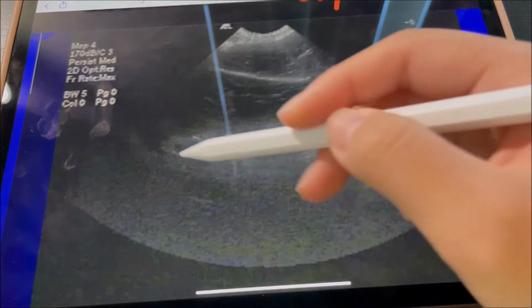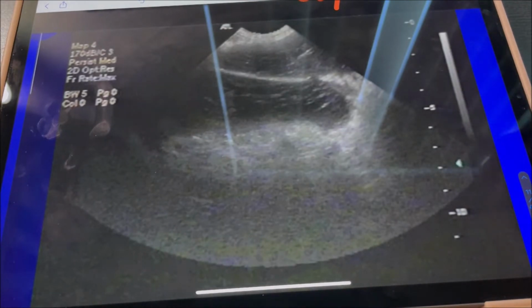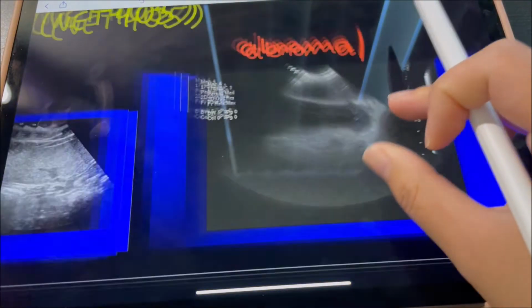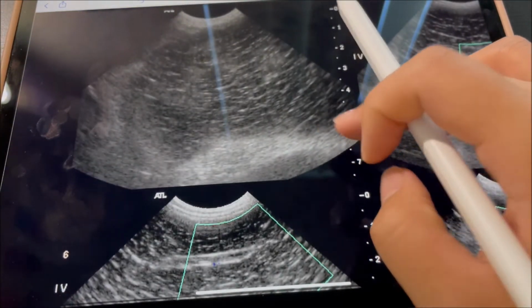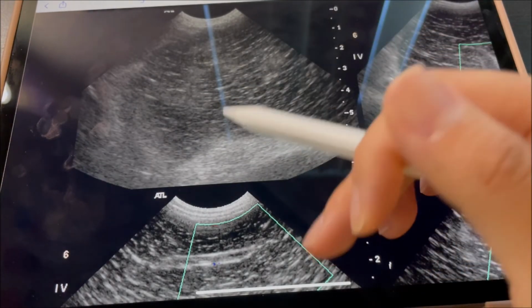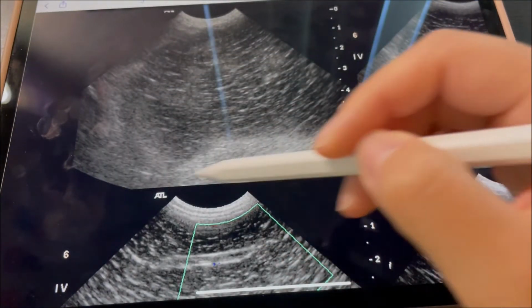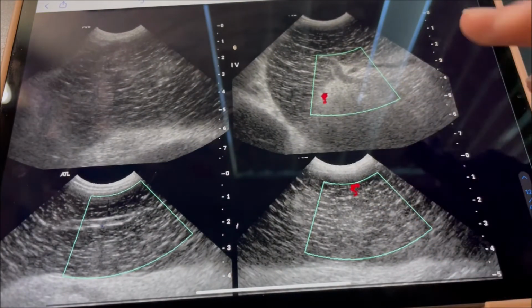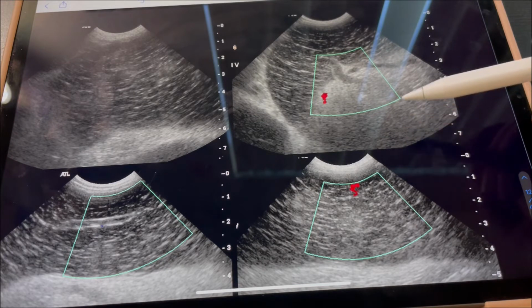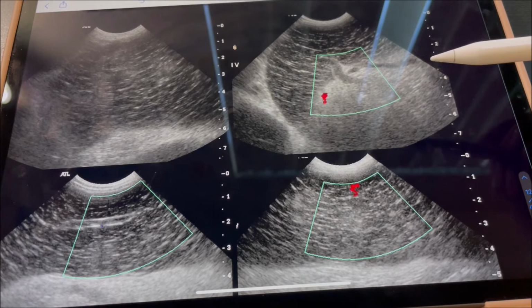And the surrounding omentum and mesentery would be hyperechoic because it's reacting to the dead spleen, so it is highly inflamed. And if we look at our patient's ultrasound of the spleen, it looks a lot like the example of splenic torsion from above. You can see the Starry, Starry Night, and the surrounding omentum and mesentery is inflamed. So now let's look at the color Doppler. And this shows that at the hilus of the spleen, where all the blood vessels are spread out, it is devoid of blood flow because the spleen is torsed and the venous outflow is obstructed.